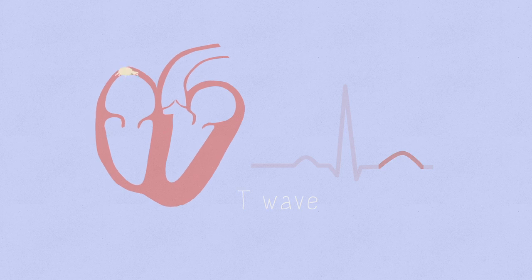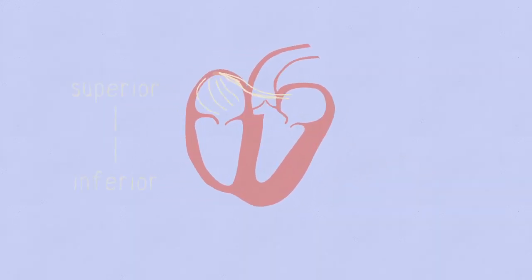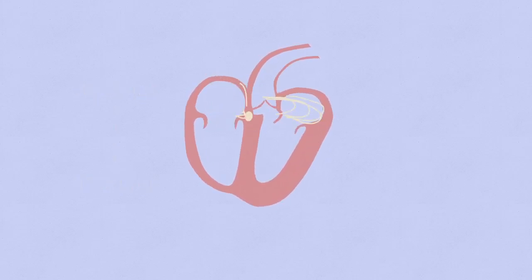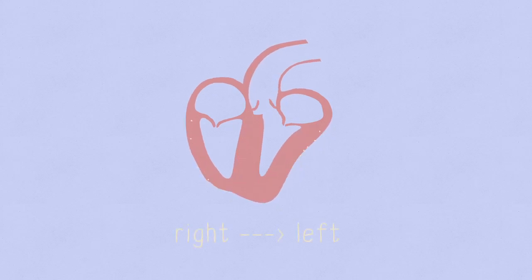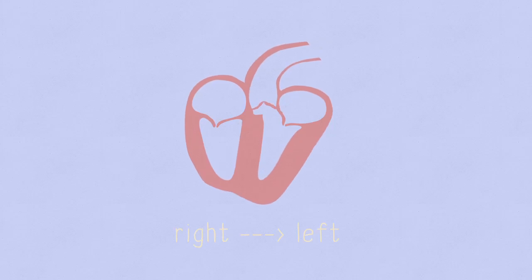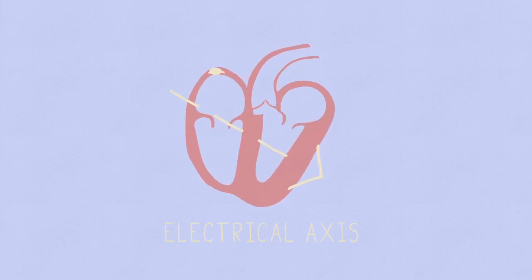The depolarization of the heart spreads from the atria to the ventricles. It is therefore from the superior to the inferior aspect of the heart. The wave of depolarization is normally to the left due to the orientation of the heart in the body and the greater muscle mass of the left ventricle. The overall direction of depolarization is known as the electrical axis of the heart.